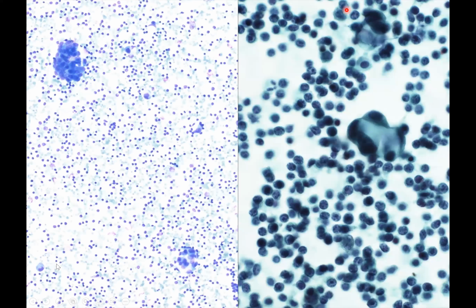Here's another case, this time a pleural fluid in a patient with known mantle cell lymphoma. So we thought we knew what we were looking for, and indeed, looking at the slide here, we can see that the lymphocytes are smallish but do have slightly abnormal nuclei, and therefore that would prompt us to do the mantle cell lymphoma panel. However, on close inspection, we can also see that there are these clusters present. The cells have nuclei pushed to the edge, a rather glandular looking cluster. The nuclei are large, they are variable, and there's a moderately abundant amount of cytoplasm.